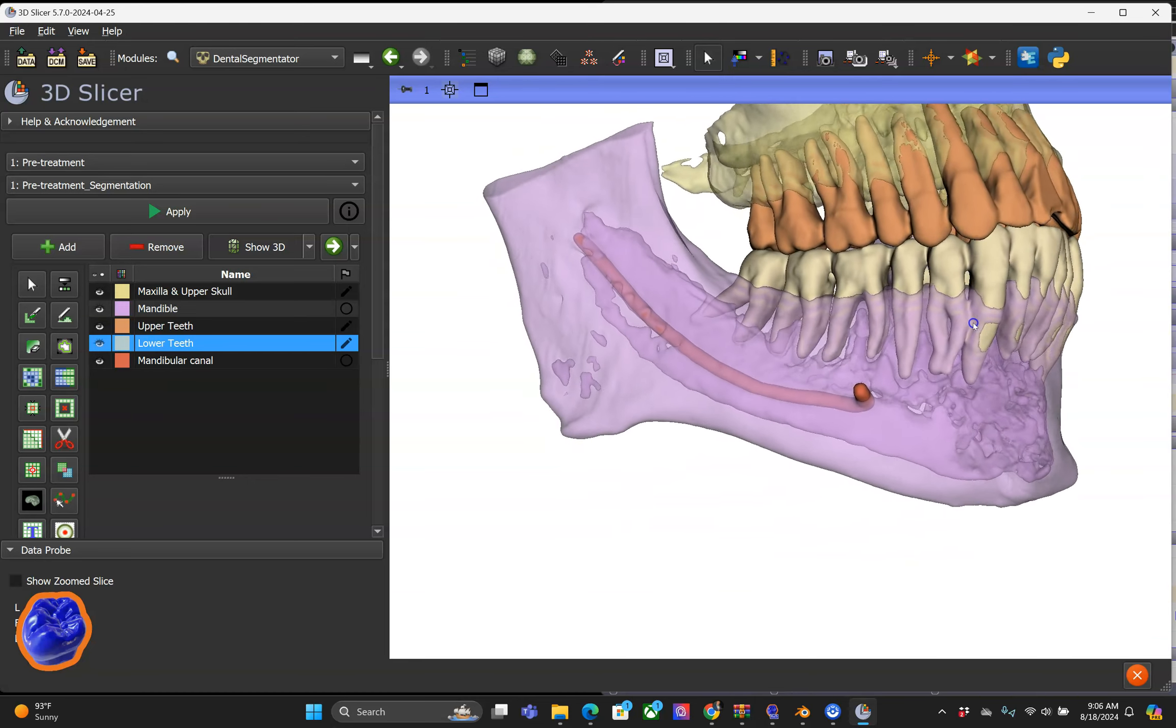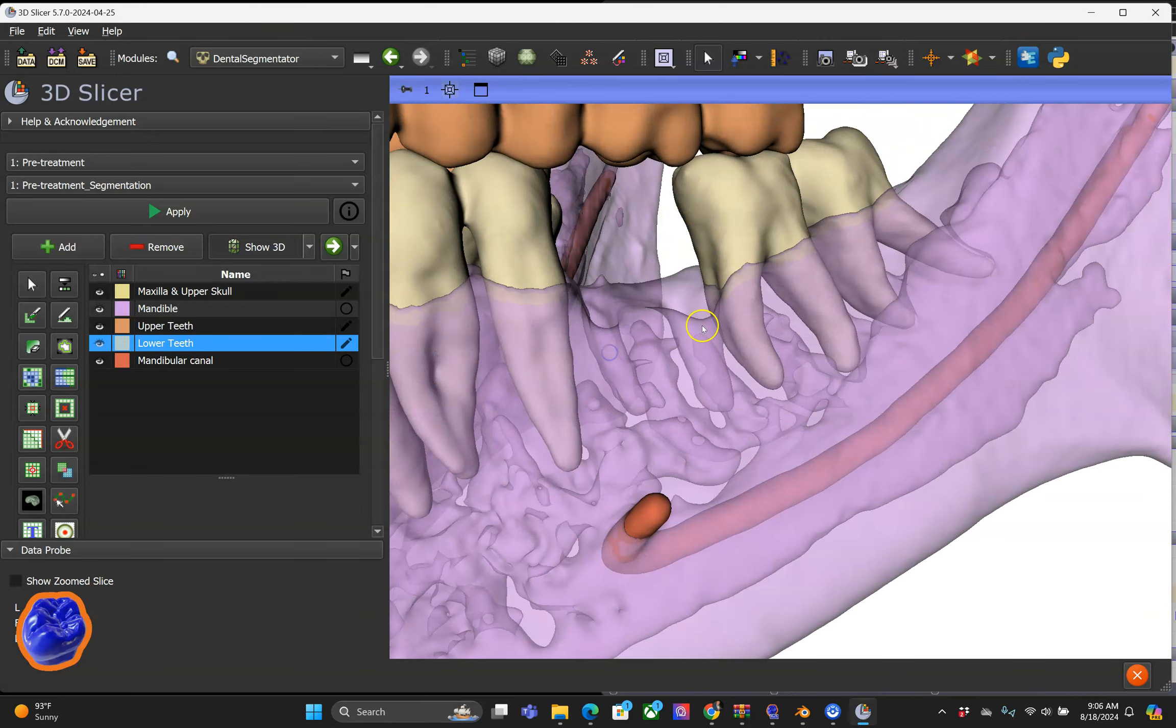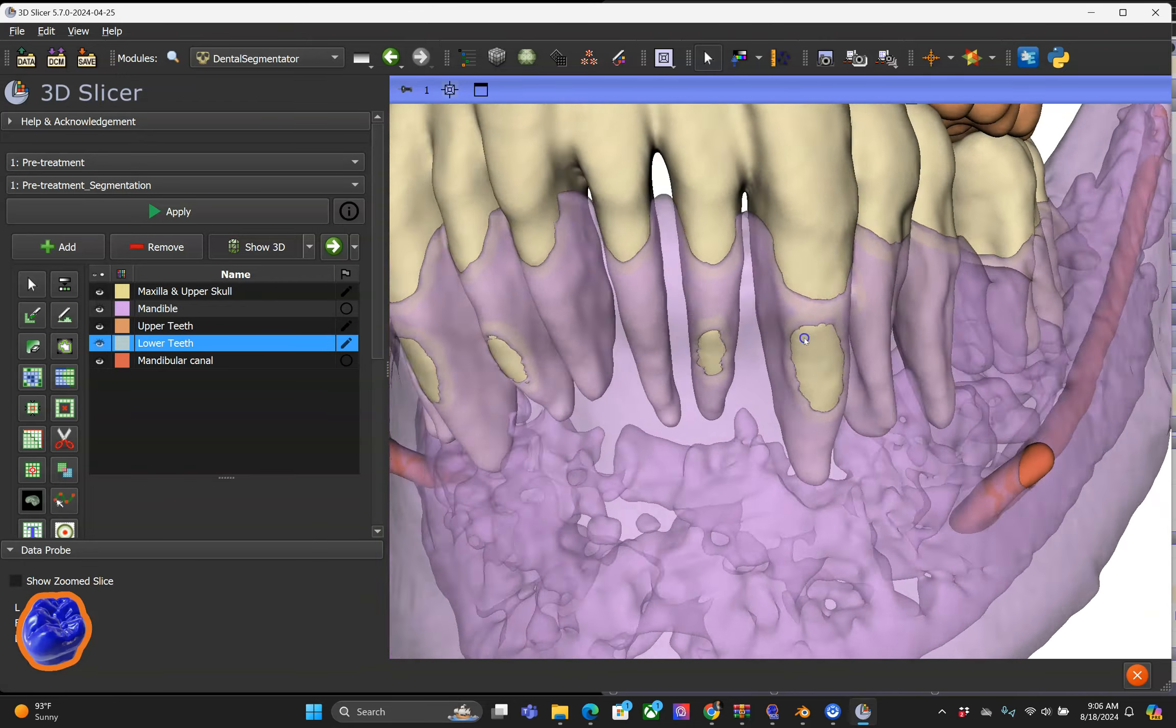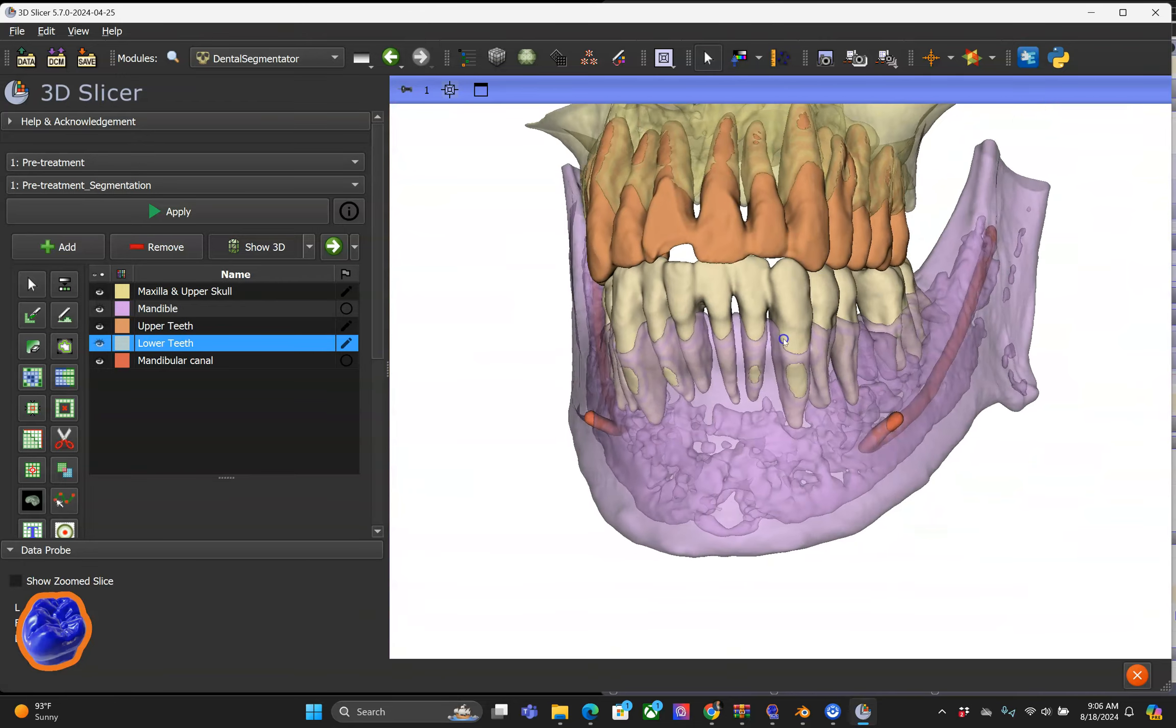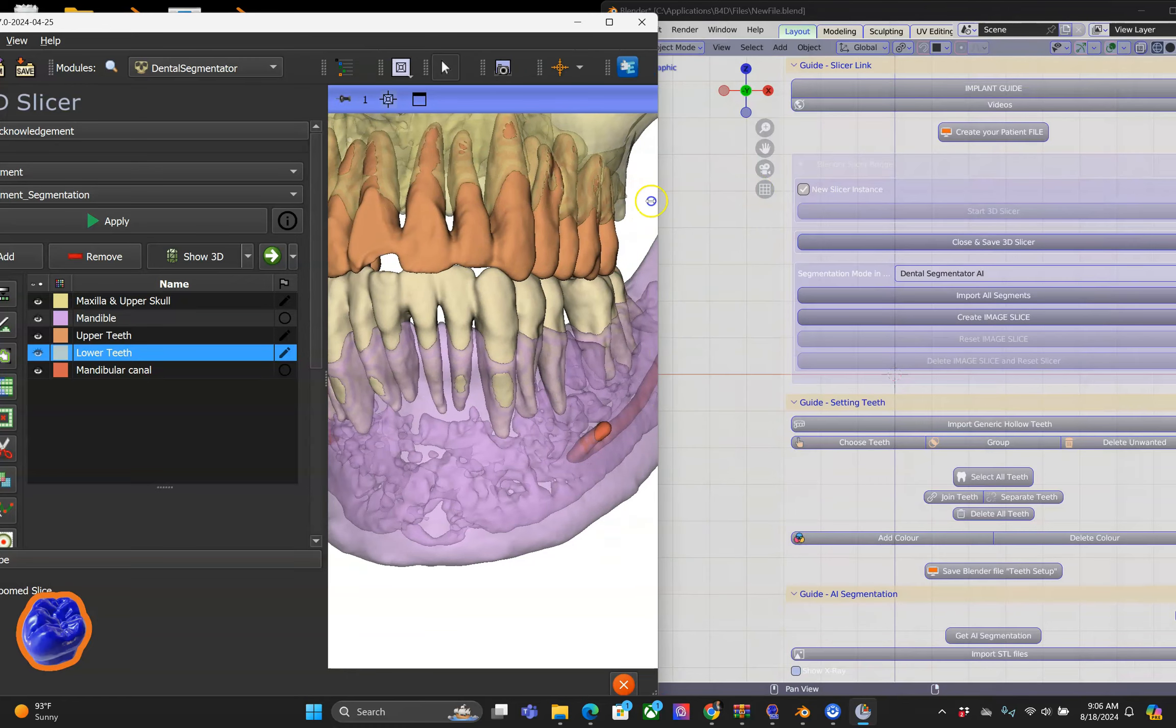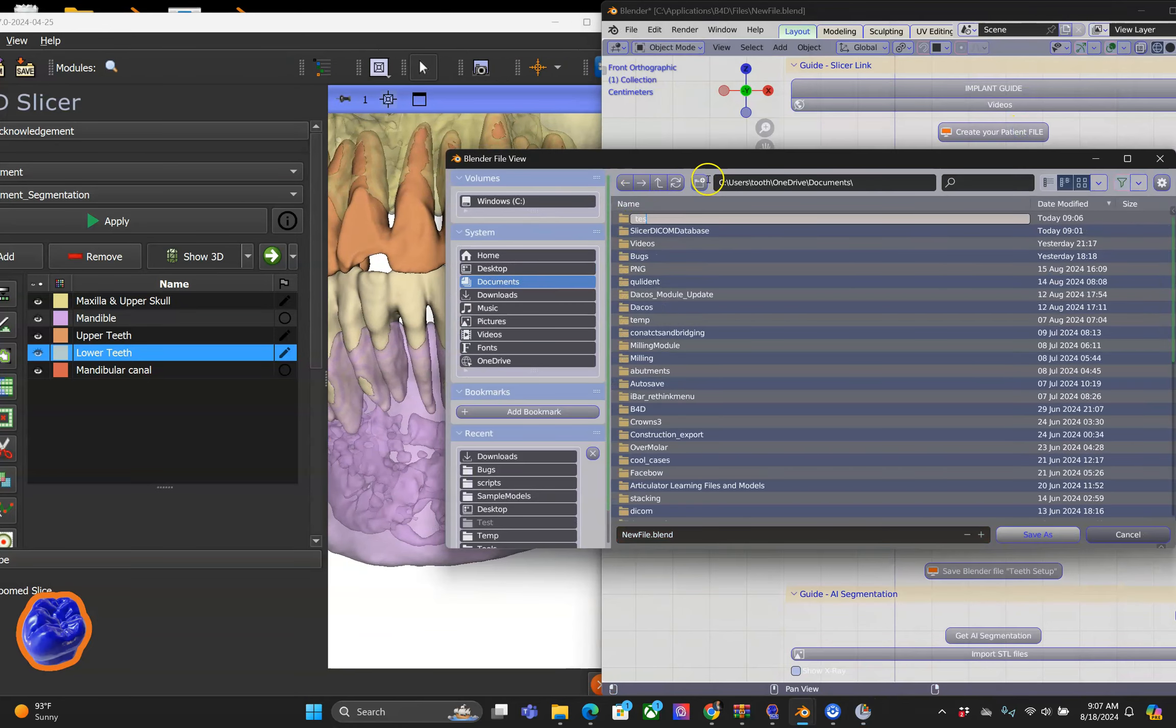What I find truly impressive is that the alveolar nerve canal has already been created, which makes implant planning very easy.